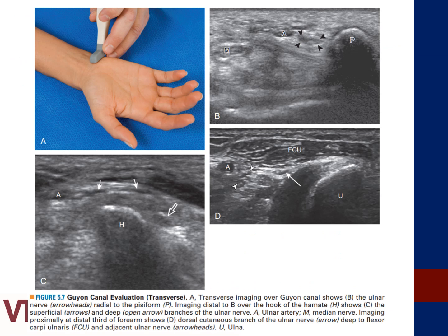Therefore, with regards to carpal tunnel syndrome, we do have the ability to utilize ultrasound for diagnostic purposes, specifically utilizing 10 millimeters squared as our cutoff for our cross-sectional area, or utilizing a ratio greater than 1.2 when comparing the cross-sectional area at the pronator quadratus and the carpal tunnel inlet. However, we cannot use that information for prognostic purposes.